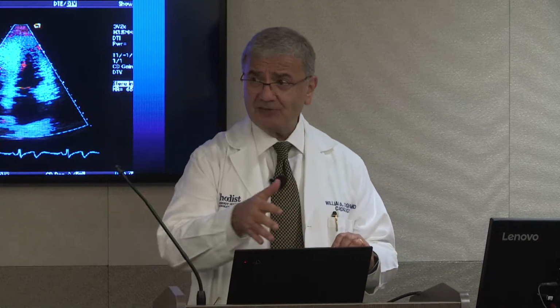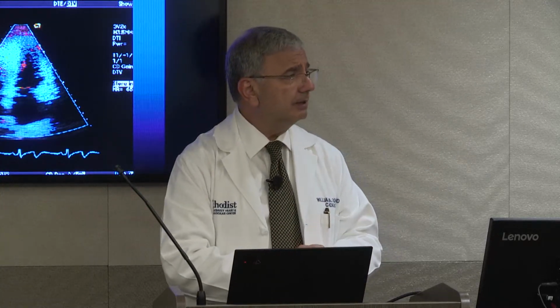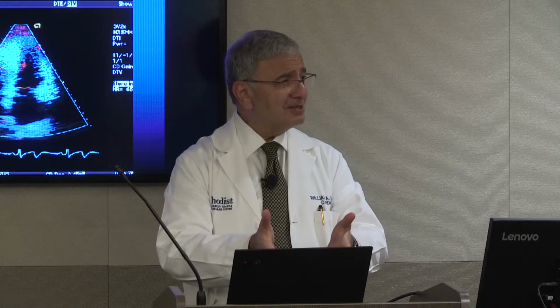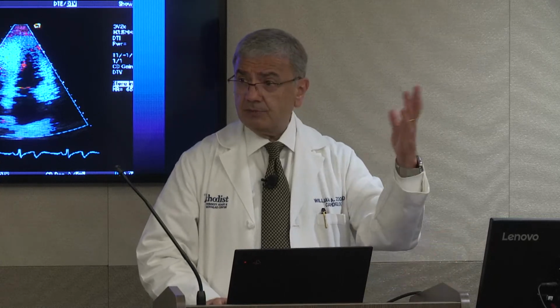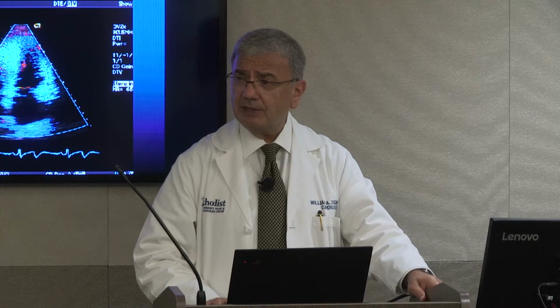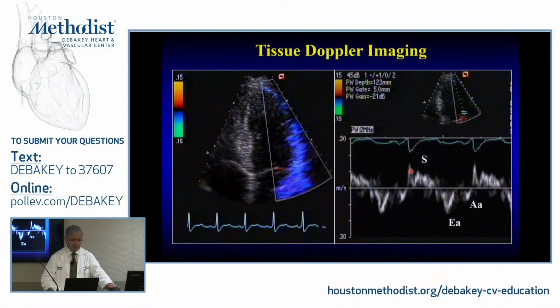So all the other pictures that I show you, I want to ignore muscle. I want to concentrate on blood. This one, I'm concentrating on muscle and ignoring blood, okay? So that's what tissue Doppler was born, my goodness, 20 years ago or something like this. In the past, we forgot it. The color is colorful, but we're not using it as much anymore.